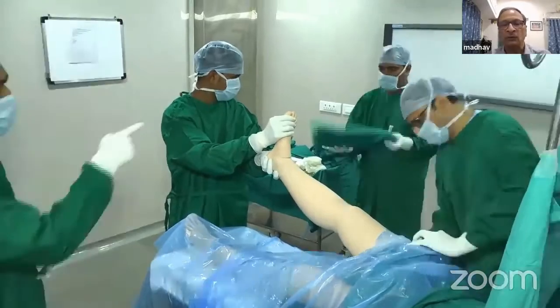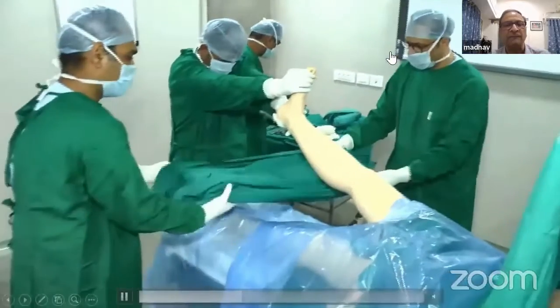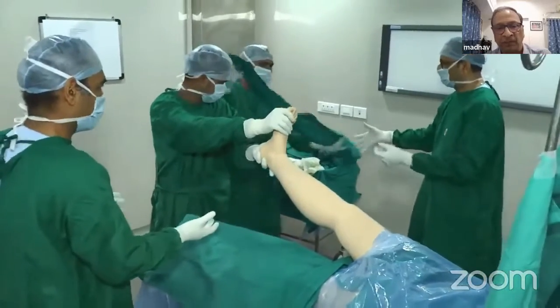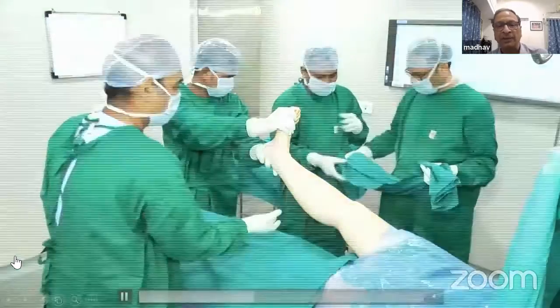After you have isolated the part with two plastic sheets, you take a medium-sized sheet. The assistant has now moved to the foot end and is holding the foot. You take the medium-sized sheet and put it on the plastic sheet below the leg.